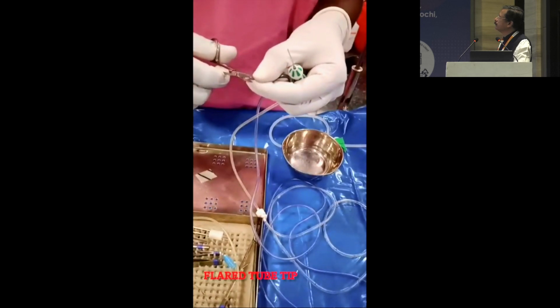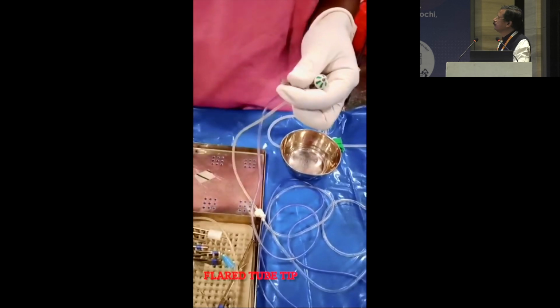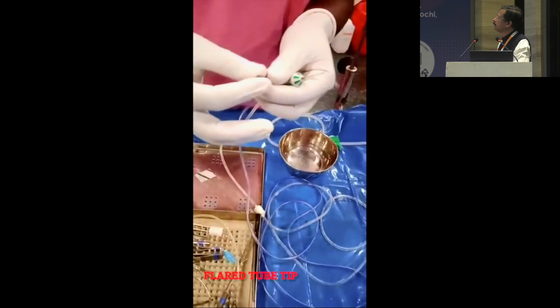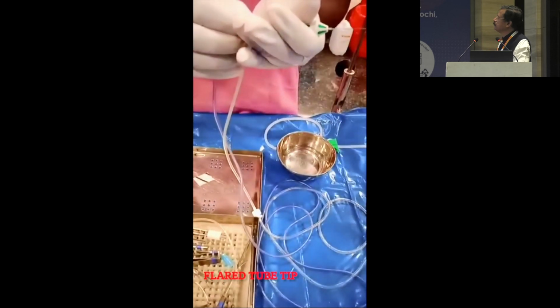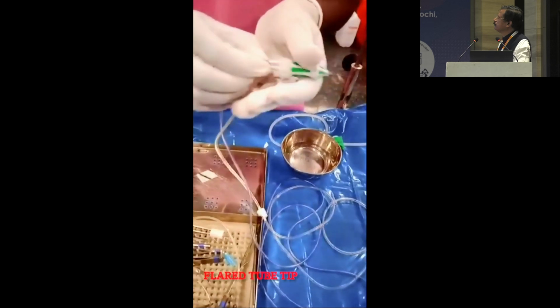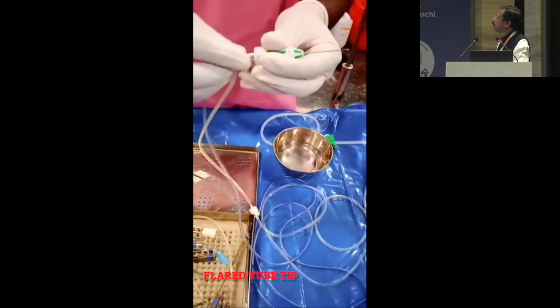At that time, the small jugaad you can do is cut the tip with scissors and refix it. So now it will be snugly fixed and it would generate normal vacuum.